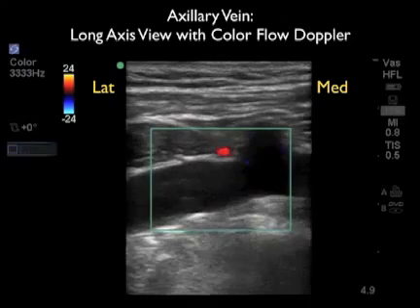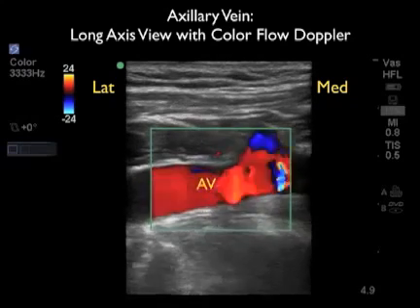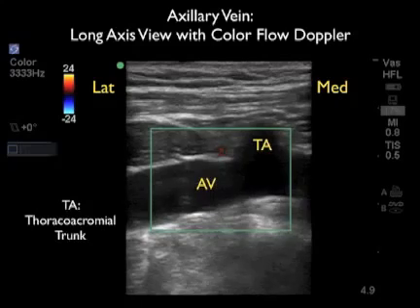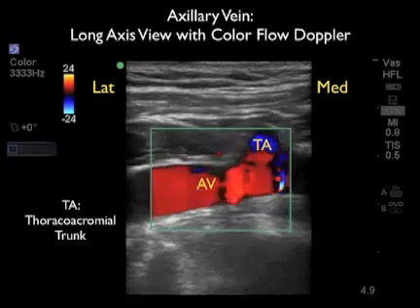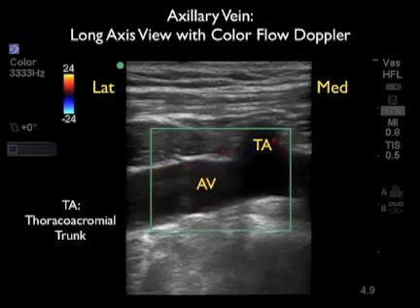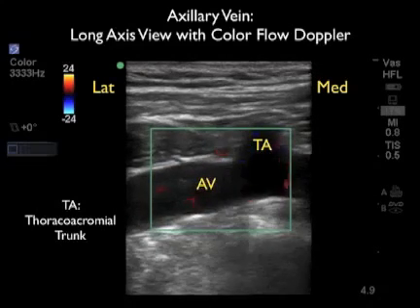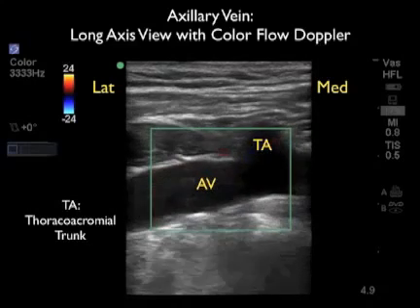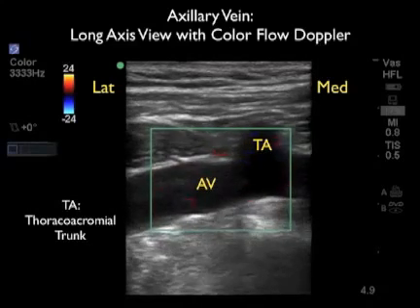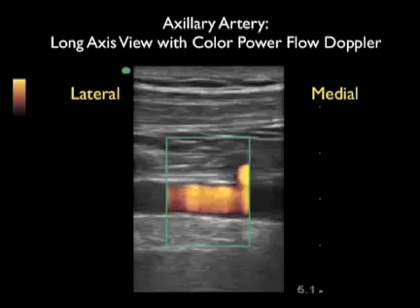Next, we'll use color flow Doppler to further differentiate venous structures from arterial. This would be the axillary vein, and we can tell this as it does not have that constant arterial pulsations within the lumen. Notice that it has the phasic respiratory variation of flow within its lumen that is indicative of a venous structure. We can also see the thoracoacromial trunk coming off medially.